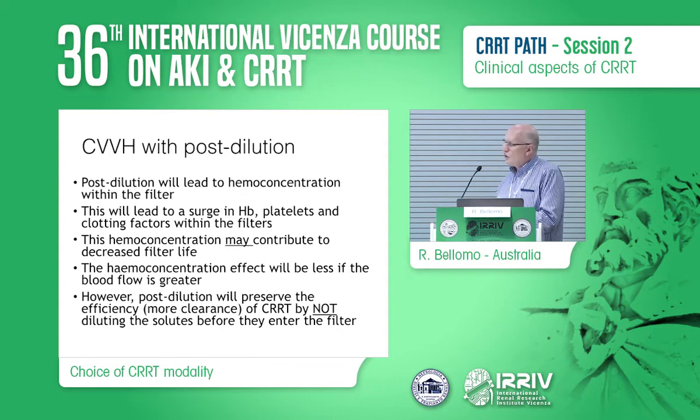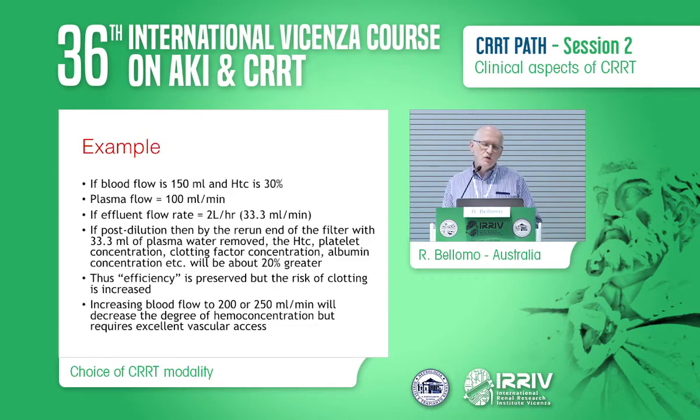And of course, just like before, that degree of hemoconcentration will depend on your blood flow, which will dictate your plasma flow, which will dictate the relationship between plasma water removal and plasma. So that's going to happen. Now, post-dilution will preserve the efficiency because it will not dilute the solutes you want to remove.